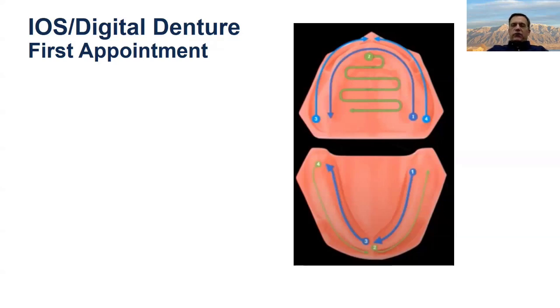Some of the older generations of scanners just weren't that good at scanning tissue, and so it really wasn't a regular thing. The second thing is the way that we scan. The more that we get into the world of IOS, the more we're discovering how important scan path is. And so I've got a little screenshot here from Dr. LaRusso, an Italian prosthodontist, who has found that scanning in this pattern gives the best result in terms of accuracy and predictability. So if you do want to take an IOS of the tissue, you're welcome to do so.